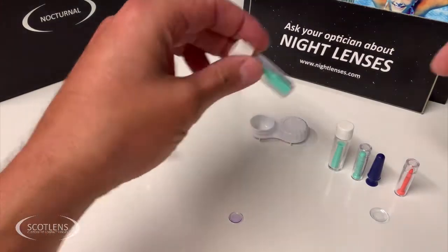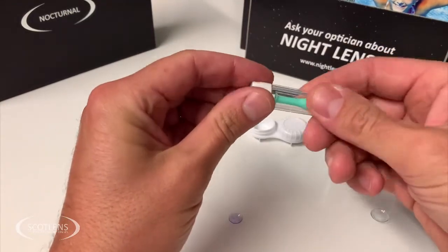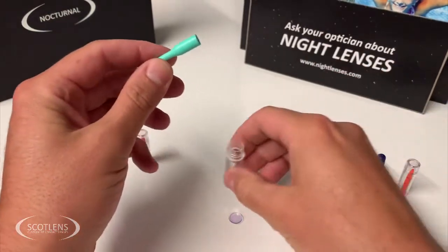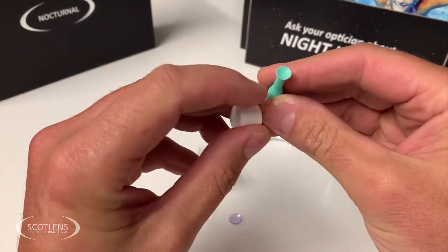Let's have a quick look at contact lens suckers and the various different types. For corneal lenses we're going to use primarily a solid style sucker — meaning it doesn't have a hole in the middle of the sucker.